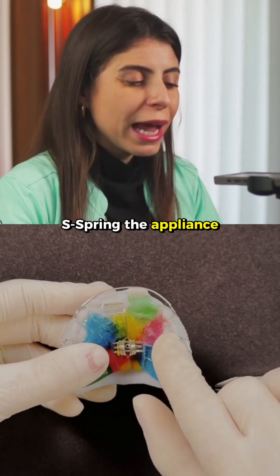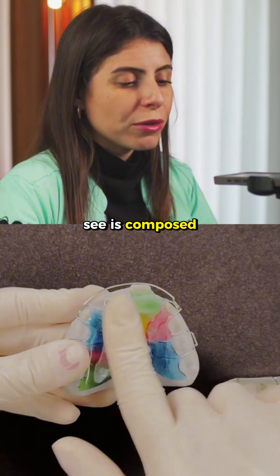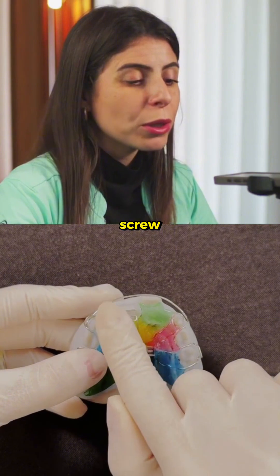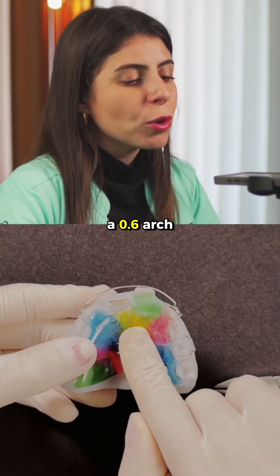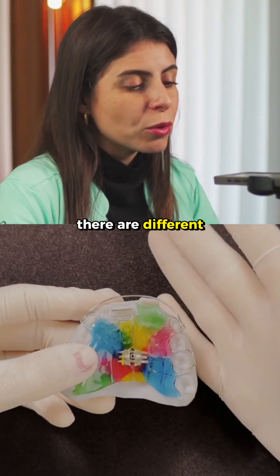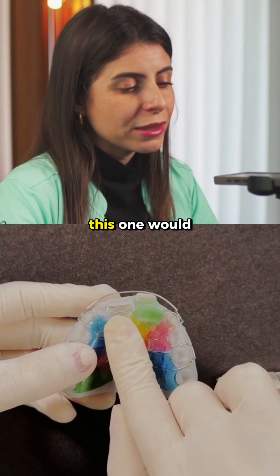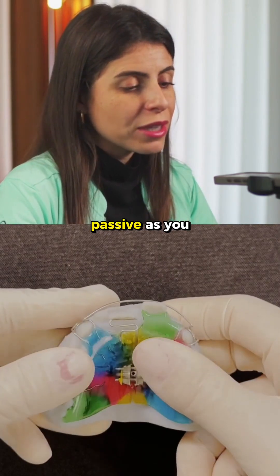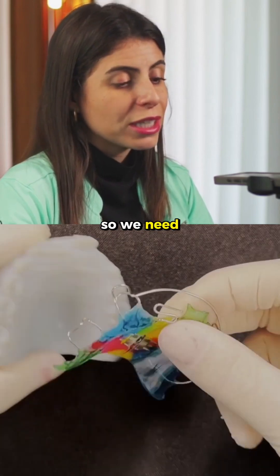The appliance, as you can see, is composed of an expansion plate that I always like to associate with an expansion screw, but with a spring made with a 0.6 arch. There are different ways to make this spring — one would be the S-shape. The appliance comes passive, as you can notice, so we need to activate it.